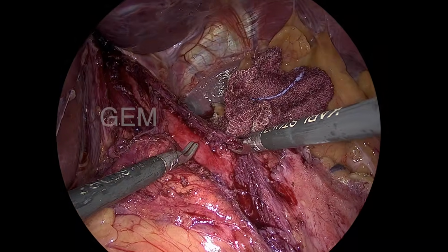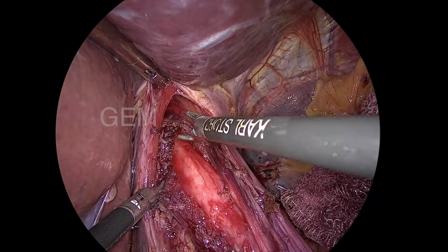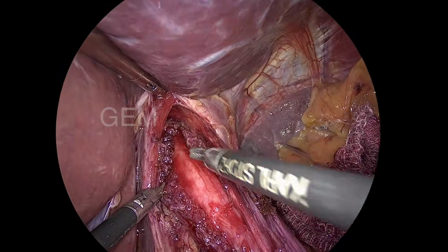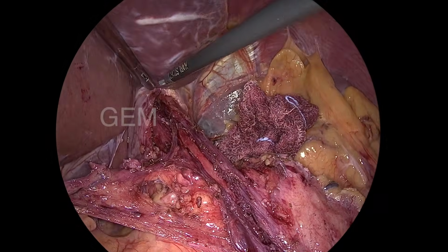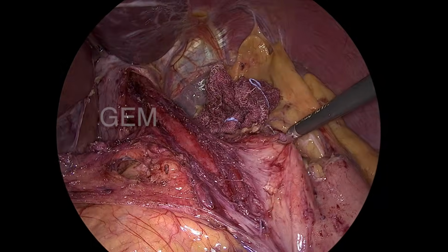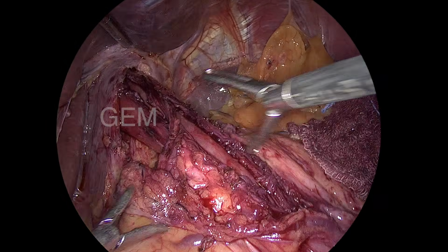So, you can see no thick mucosa. Esophageal mucosa is always thick, only the gastric side will be thinner, and if there is any bleeding in my myotomy area, I do not apply cautery immediately. Now, you can see the length is almost around 11 to 12 centimeters. So, that is enough. I am going for a Toupet fundoplication now.